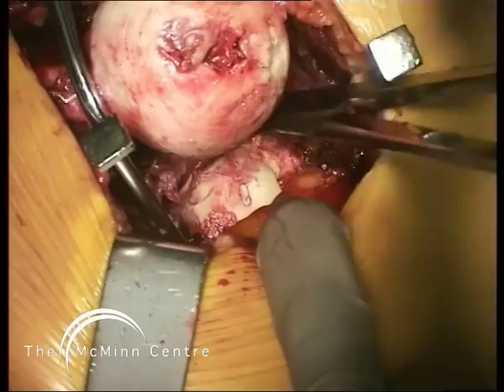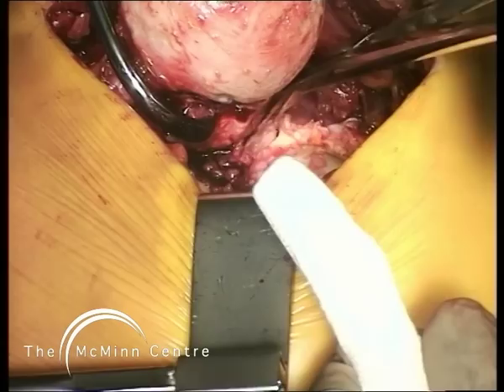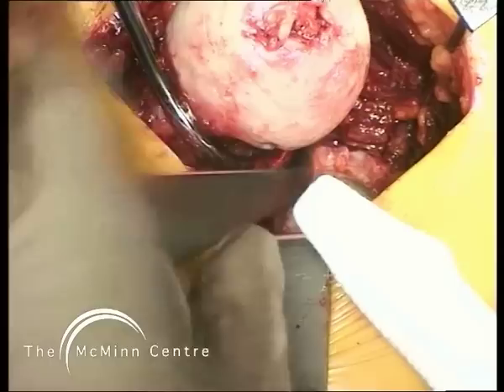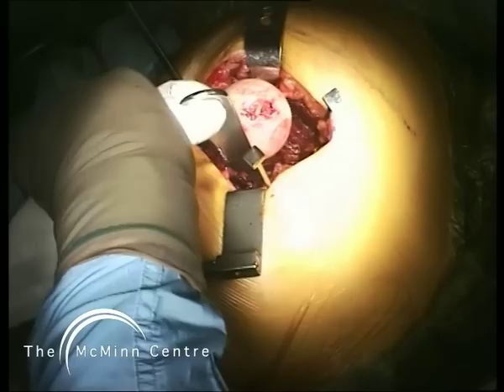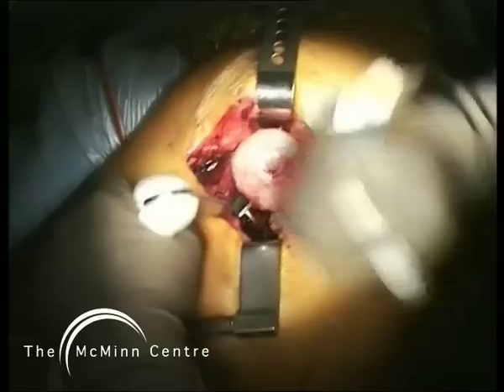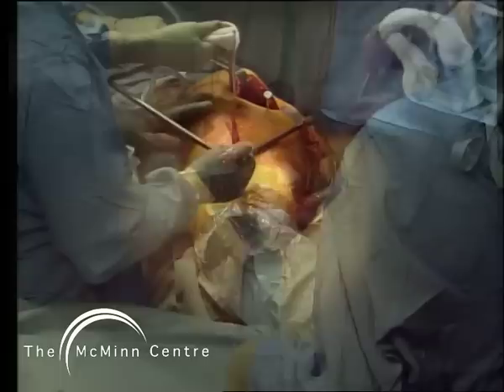We've got to get the femoral head and neck out of the way to allow us to work on the acetabulum. With a hook we pull the femoral head and neck upwards and forwards. I'm going around the anterosuperior acetabular edge with scissors, cutting capsule, muscle, and reflected head of rectus femoris, keeping the scissor tip absolutely close to the bone. When completed, we put a retractor in and drive the tip halfway between the edge of the acetabulum and the anterior inferior iliac spine. The leg is then rotated and you can see the femoral head prolapsing under the abductor muscles, allowing it to be displaced anterosuperiorly and gaining access to the acetabulum.